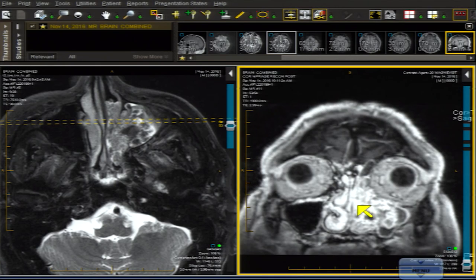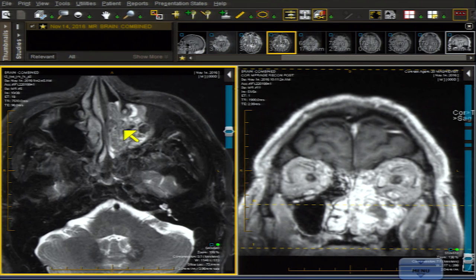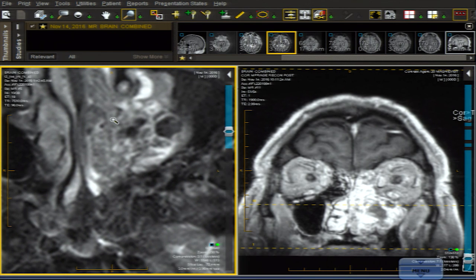So those are the checklist tip-offs to differentiate squamous cell carcinoma from the cerebriform inverting papilloma, which is epicentered right here — and that's the diagnosis in this case. From a surgical perspective, the two things to remember are: location at the uncinate process in the middle meatus, and the cerebriform appearance — think of it as a brain shoved up somebody's nose. It does look very cerebriform here, with gyri and sulci visible, which is a real tip-off to the diagnosis of inverting papilloma.